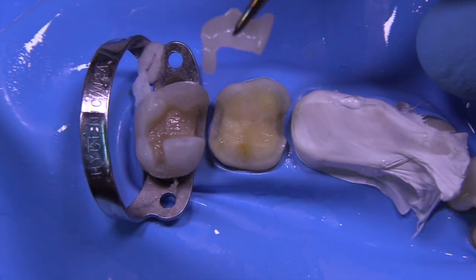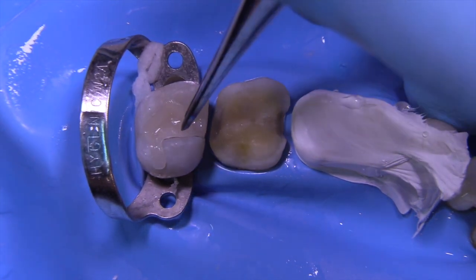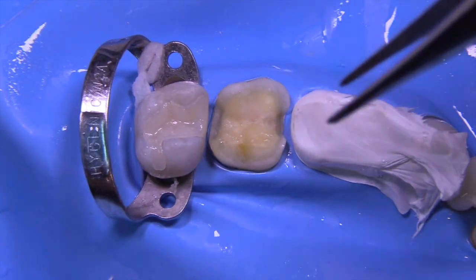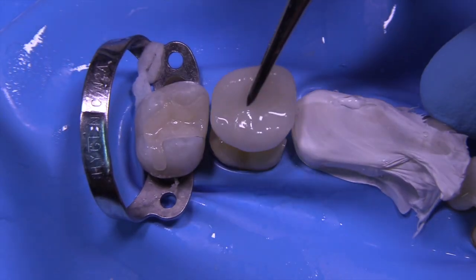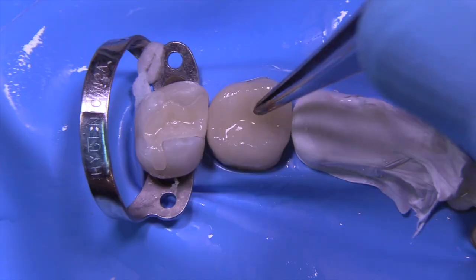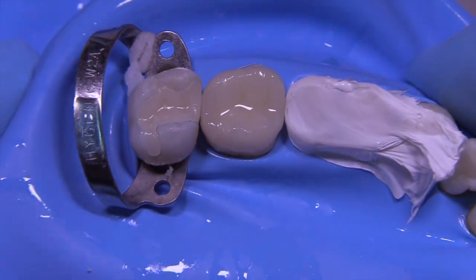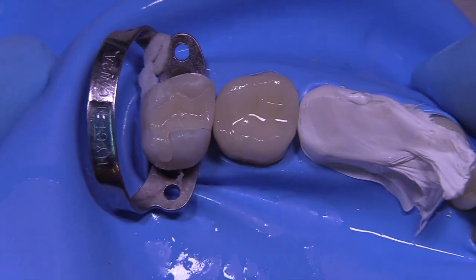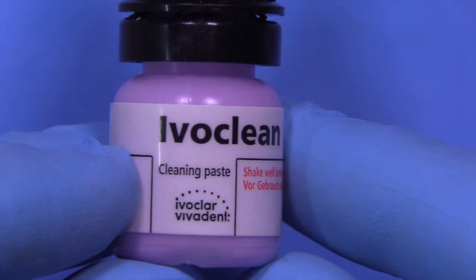A little Teflon tape on the premolar. We're going to try in these pressed ceramic restorations and see if they fit reasonably well. It's just never quite as good as the fit of gold — gold restorations can be made to fit within five microns — but not to worry, we're going to be able to create a continuous seal from the ceramic to the tooth with the technique I'm showing you.